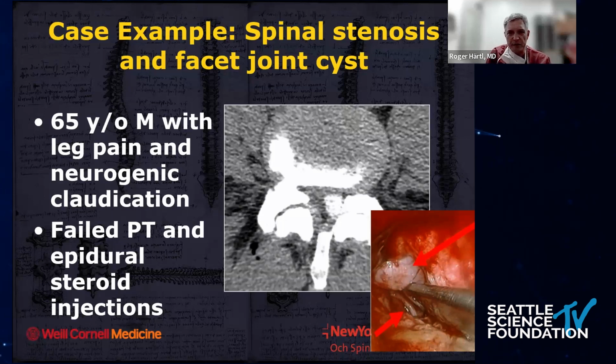I published a paper maybe 10 years ago where I described doing these from a contralateral approach through a tube. So just the decompression coming in from a contralateral approach. My rationale at the time was that you come from a more normal anatomy, and then you see the cyst, and that's on this little photograph here below, where you come from the contralateral side, and then you dissect the dura away from the cyst under the microscope, and then you can remove the cyst from the contralateral side.